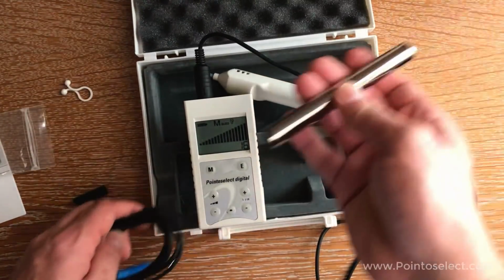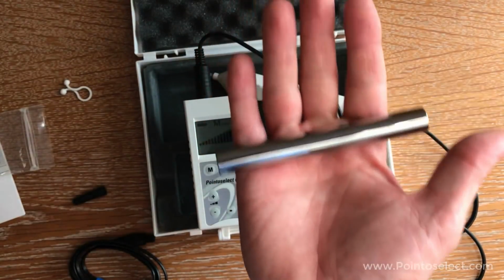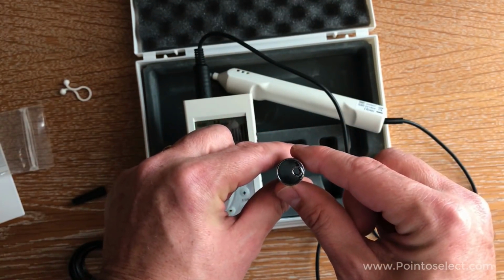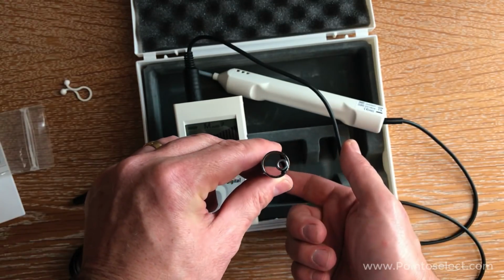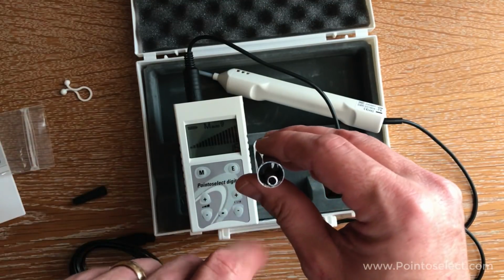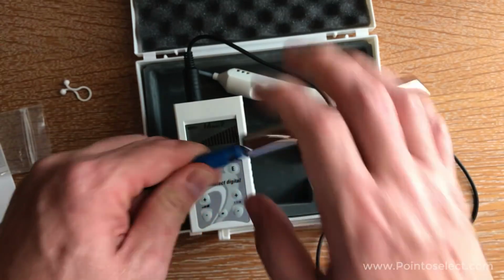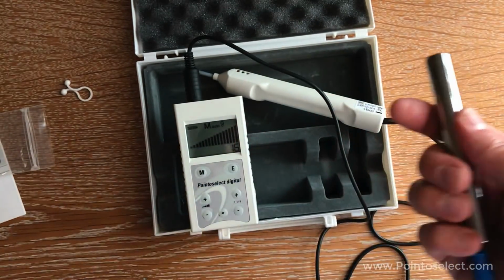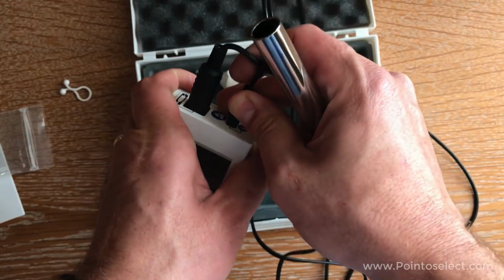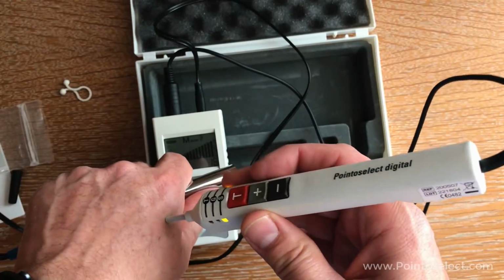And look at this. Now that's a ground bar. I got pretty good size hands. That's more than a handful. But it's also hollow. Can you see that? You can see right through. It's a tube. It's a hollow tube with another tube kind of soldered inside there. So we'll connect up our tube to our tube. Connect that up. There we go. Okay. Let's see what we got.